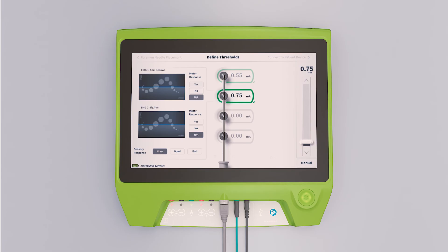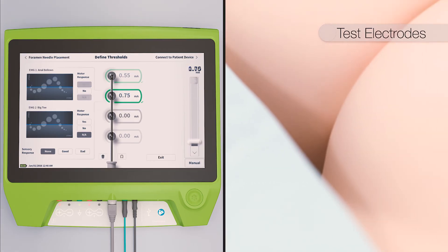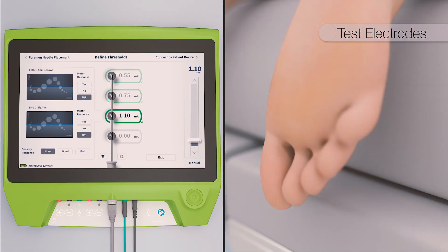The goal is to obtain the desired motor response, bellows, followed by big toe flexion on all four electrodes at thresholds of two milliamps or less.